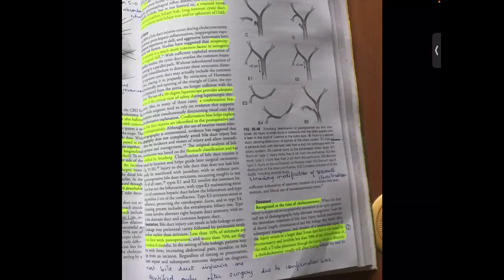Another one is, with sufficient cephalad retraction of the gallbladder, the cystic duct overlays the common hepatic duct, running in a parallel path. So without infralateral traction, as I told you at the start, that infralateral traction of the Hartmann's pouch or infundibulum is very important. That will separate the cystic duct and the hepatic duct, or else it will be parallel with the hepatic duct and we may injure the hepatic duct along with the cystic duct. Then another thing is the 30-degree laparoscope. Nowadays we are using only the 30-degree laparoscope. The 30-degree laparoscope is adequate for visualization of the CVS, the critical view of safety.